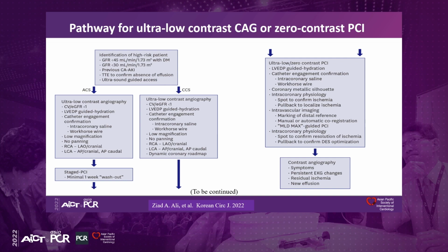If we perform this PCI, we should also give hydration with normal saline, with LVEDP guidance. During PCI, we should use intracoronary imaging, especially IVUS, pre, during and post PCI to guide the stent implantation and minimize the contrast volumes. Next.